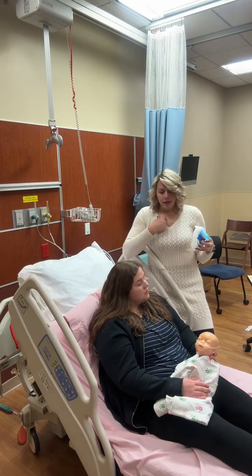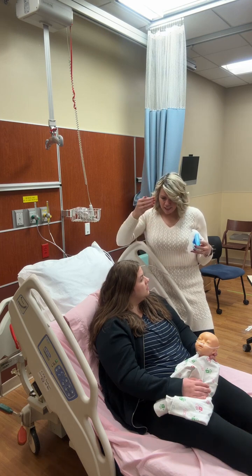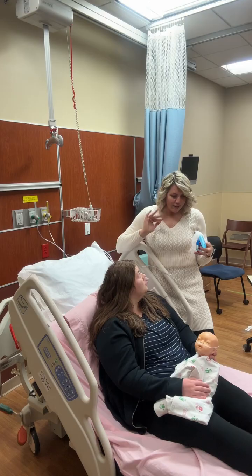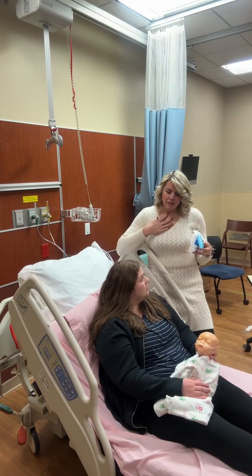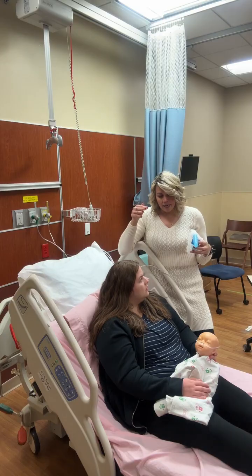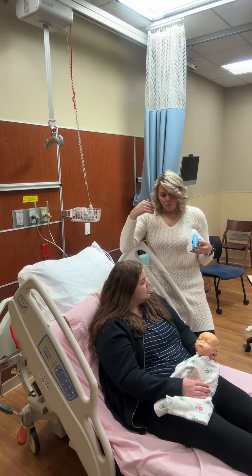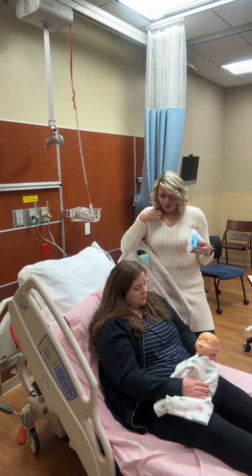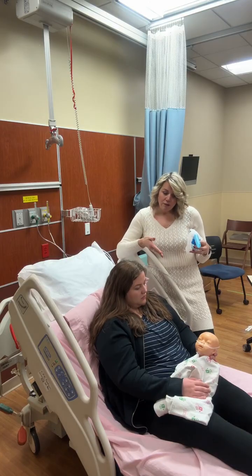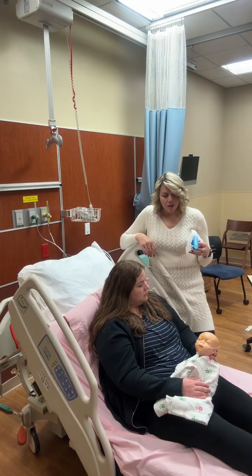And sometimes when this occurs, when we're giving the breathing treatment, sometimes you'll see the pulse ox may look like it's going to drop for a second. That's normal. It's a mechanism of the medication, but it will come back up, and sometimes it can make the heart rate go higher. That is a side effect. We'll be watching baby to make sure. Just as a reminder, baby's heart rates are a little bit higher anyways, but we're going to watch it. I'm going to be right here with her. I'm not going to leave her.